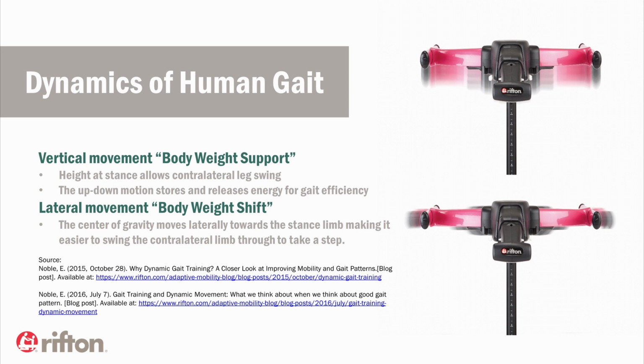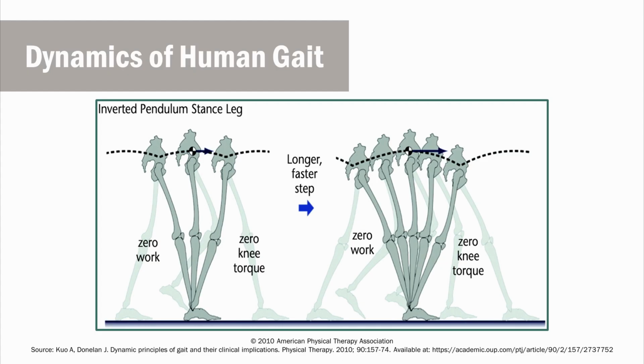So when talking about dynamic gait systems, we're focusing on the device's ability to accommodate the movement of the center of gravity, because restricting movement will hamper that naturally occurring mechanics of step taking. Here's another visual that makes the point.